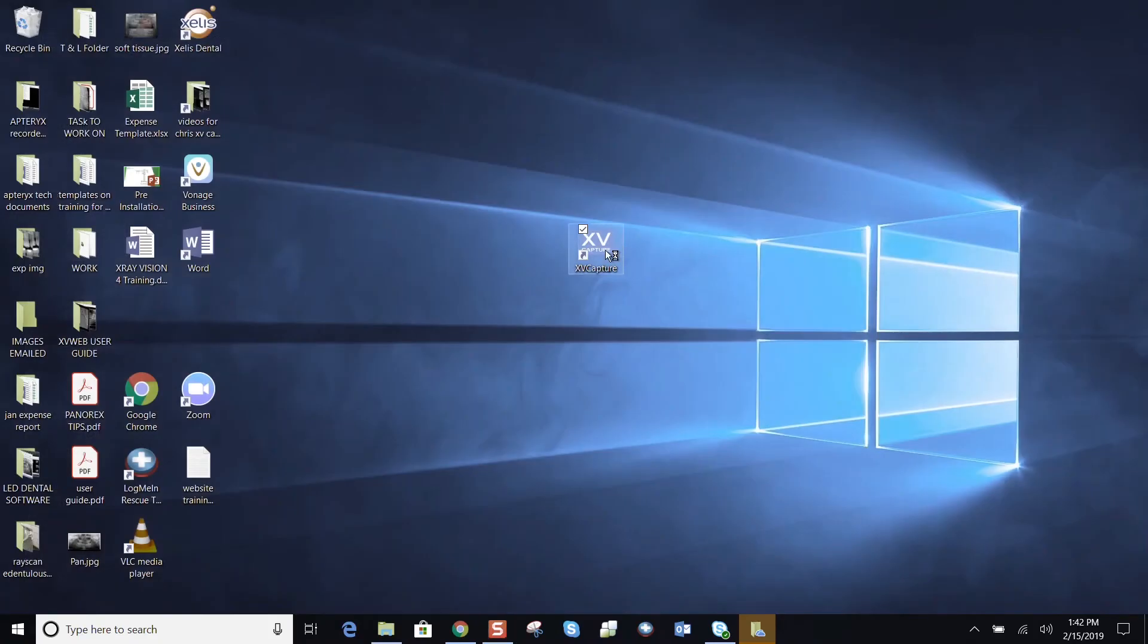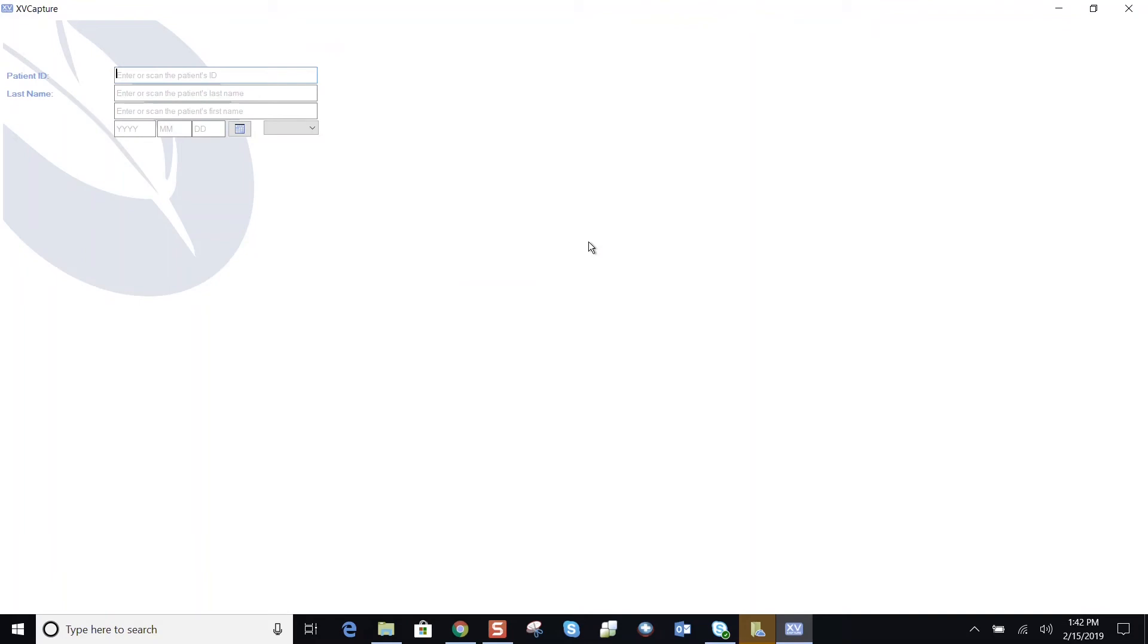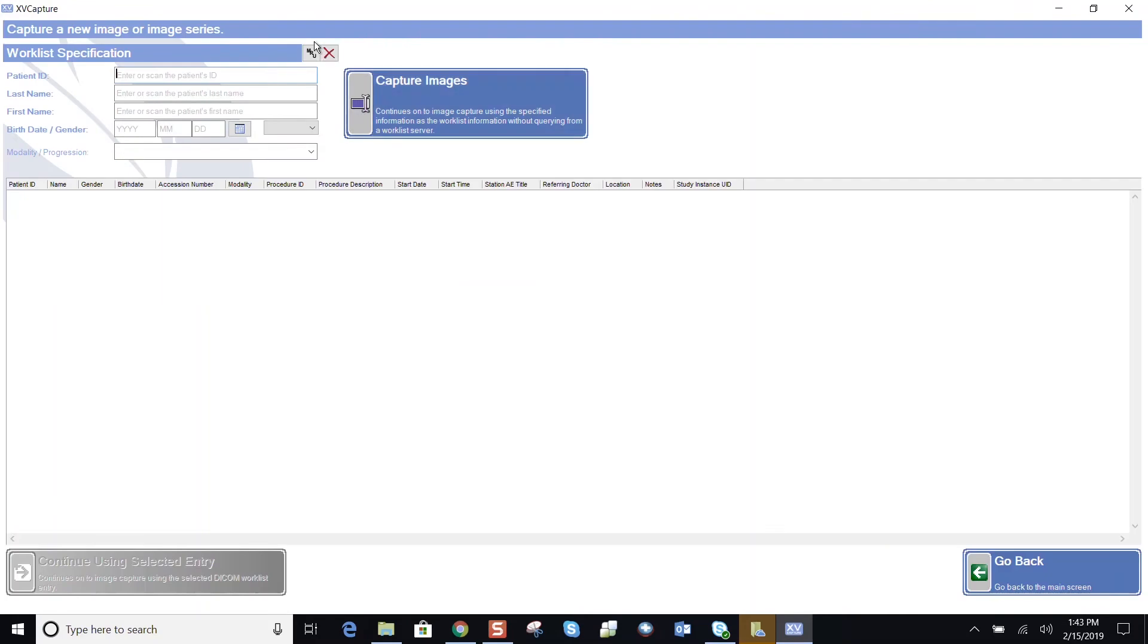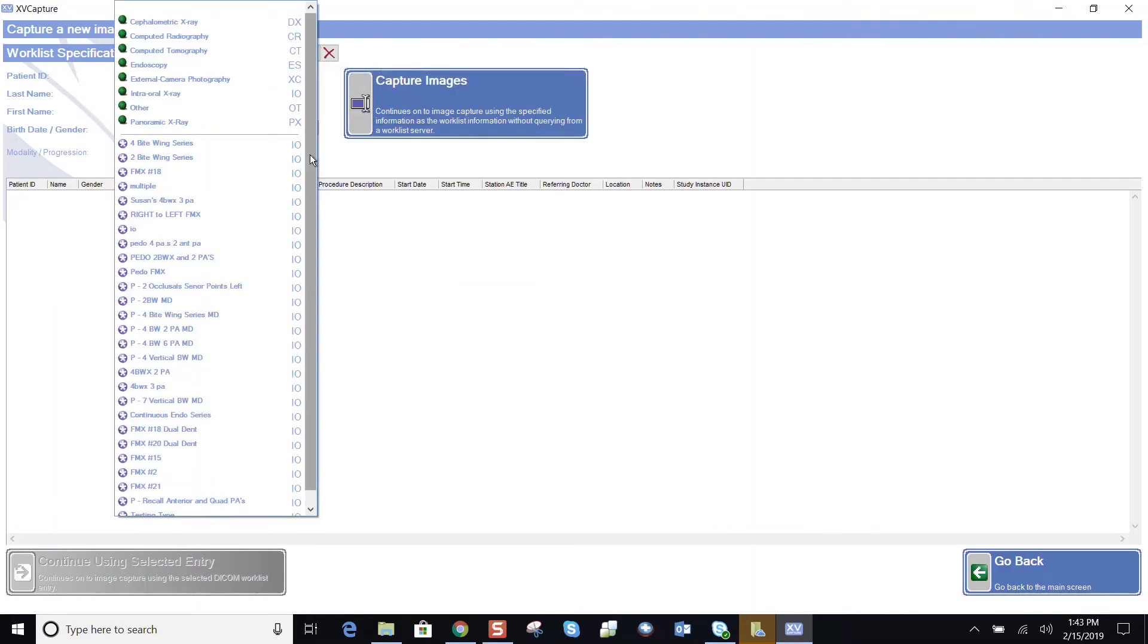And when I'm opening the software, and I'm in my capture mode, I should be able to find that layout easily. I have four bite wings and two PAs here.